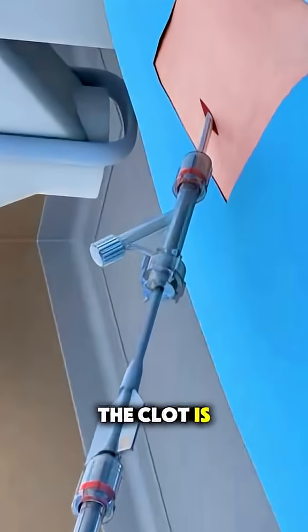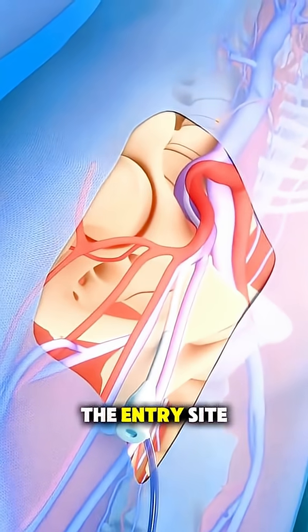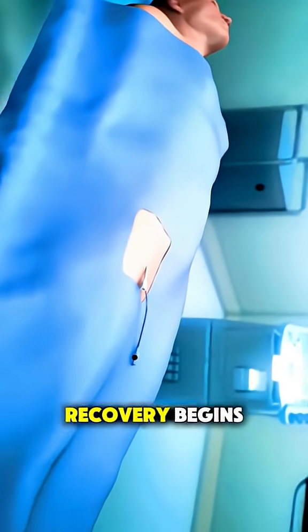After the clot is removed, the catheter is withdrawn, the entry site is sealed, and recovery begins.